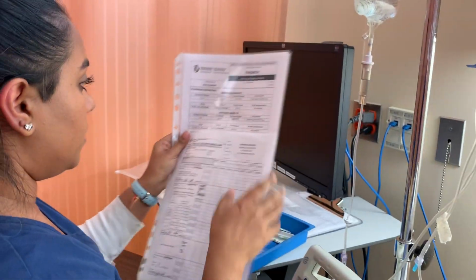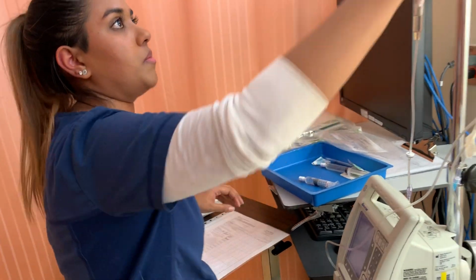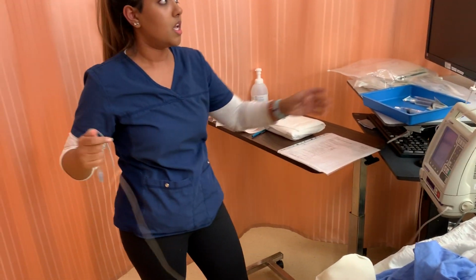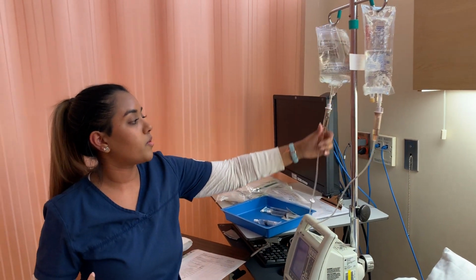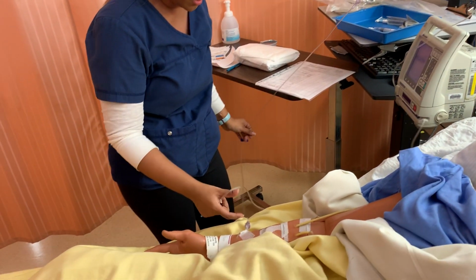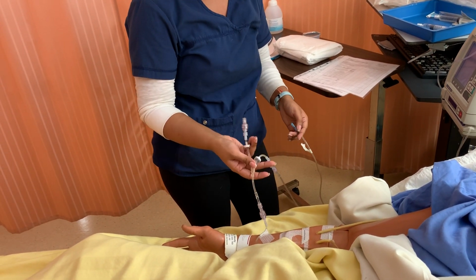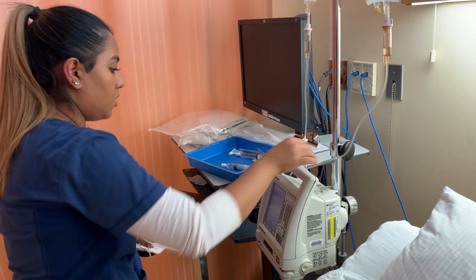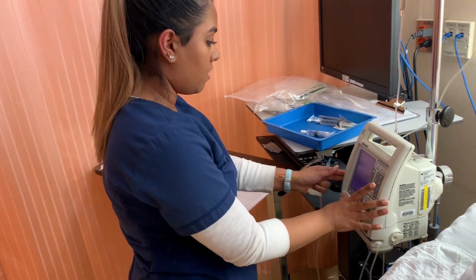Okay, so I'm just going to make sure this is the right tubing here. We have primary tubing with no ports. We have the normal saline running TKVO via gravity. It's already attached to my patient. The Y is primed. Everything is primed. We know that the patient's IV is patent. So I'm just going to program my pump now.